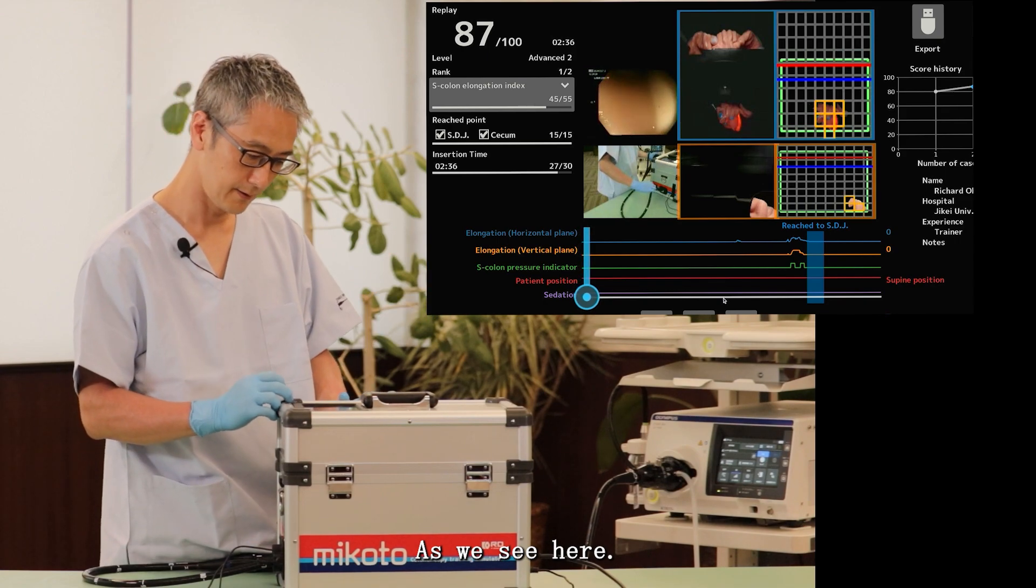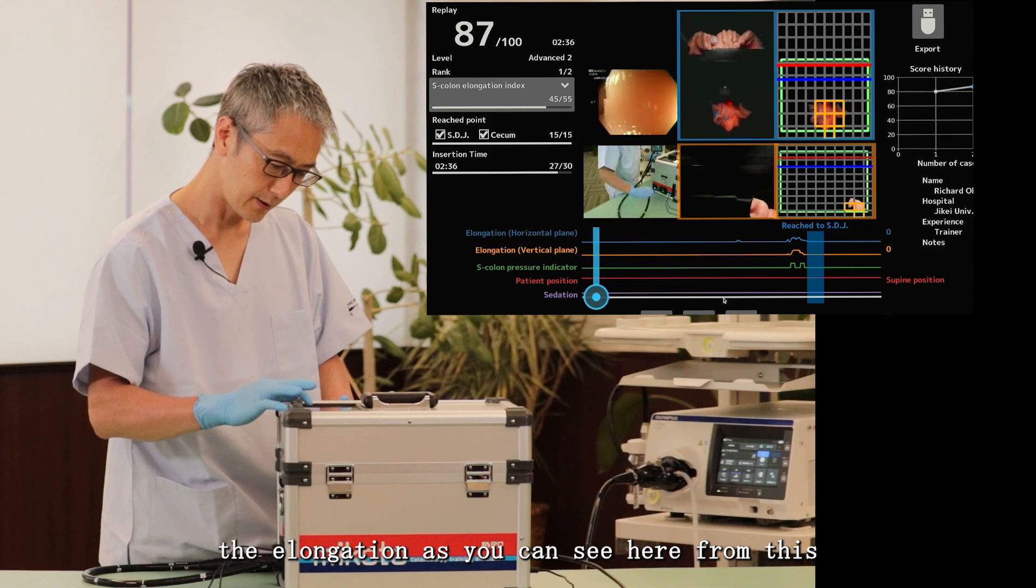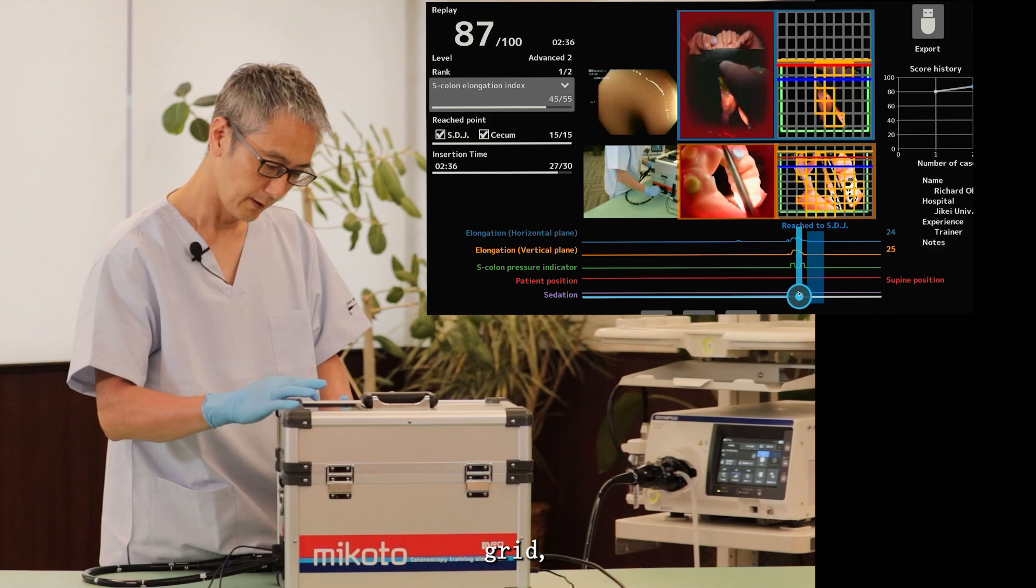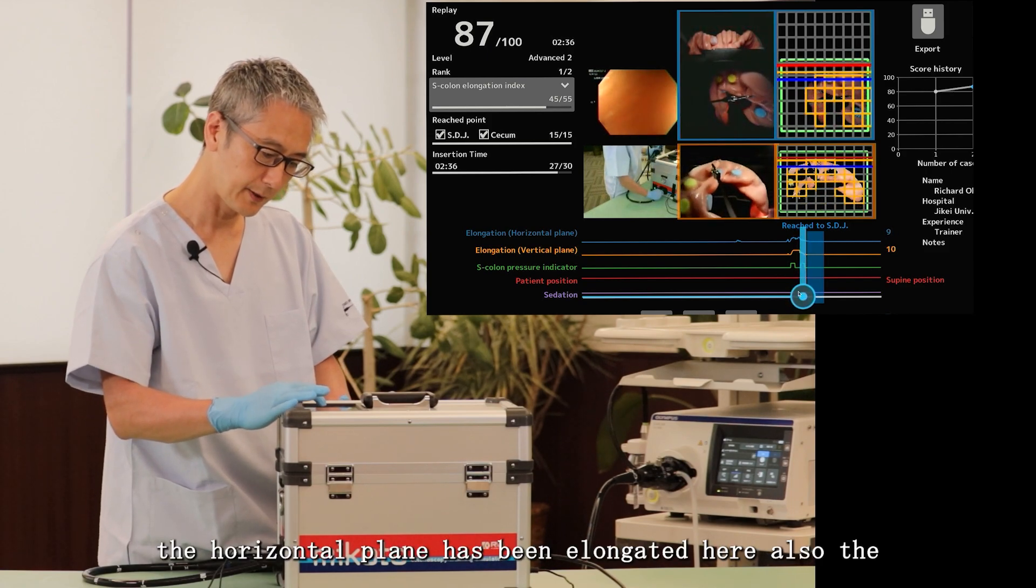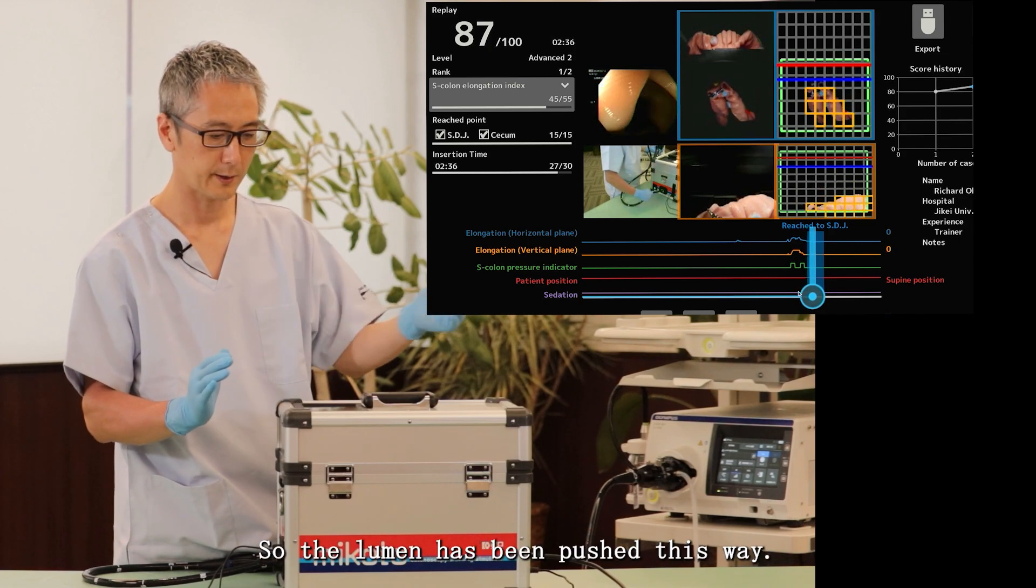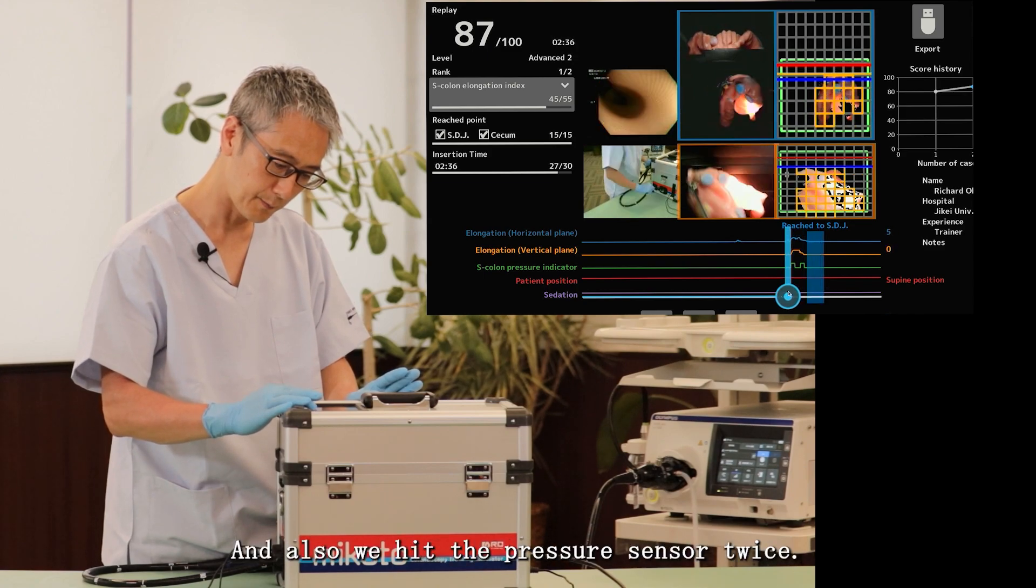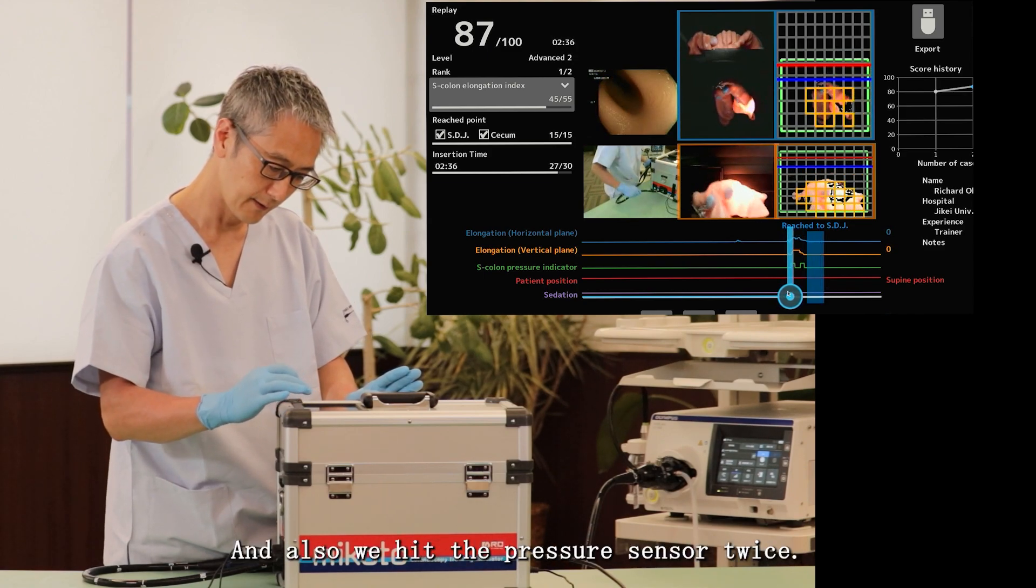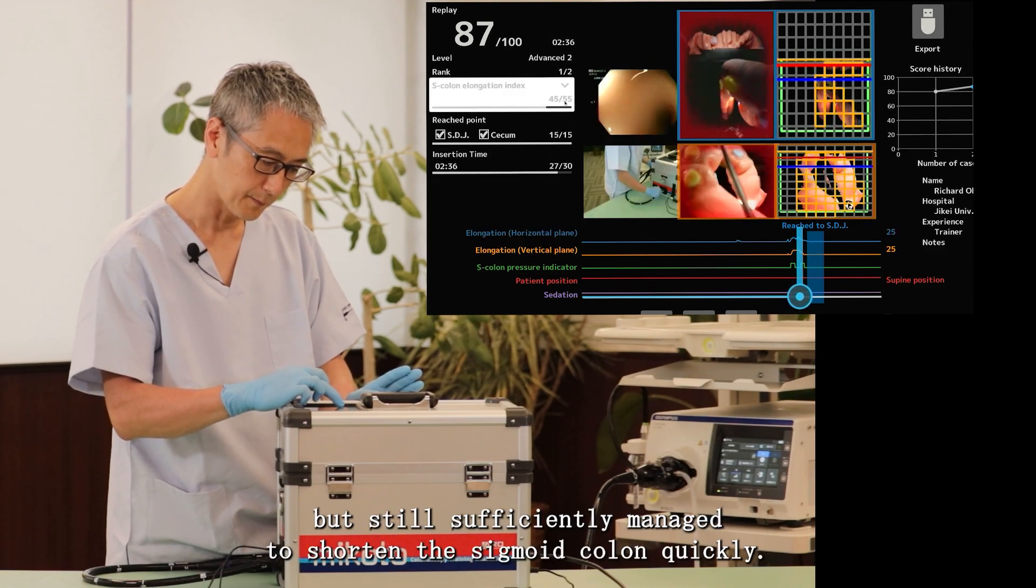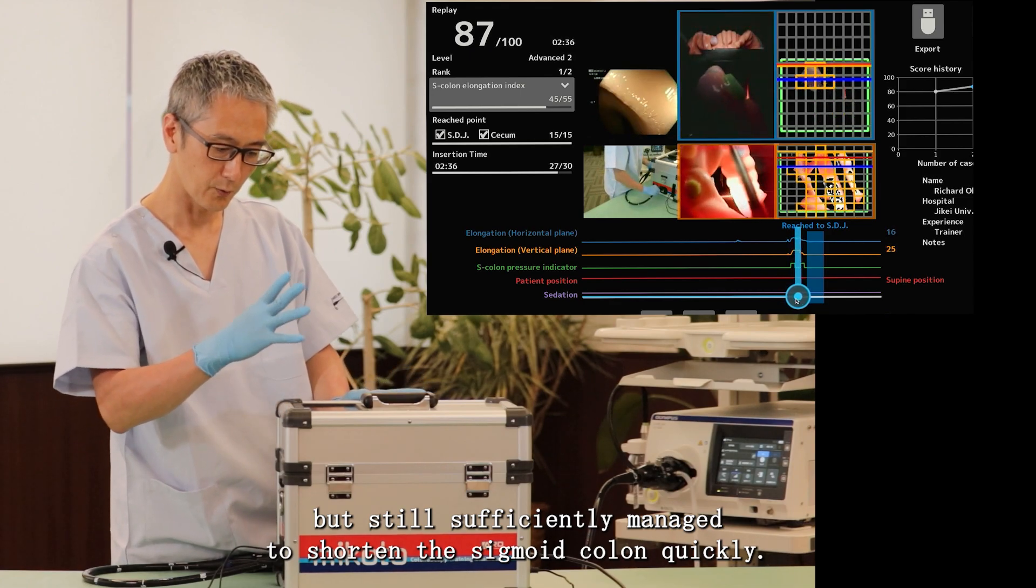As we see here, again the elongation, as you can see from this grid. The horizontal plane has been elongated here, also the vertical plane. So the lumen has been pushed this way, also this way. And also we hit the pressure sensor twice. That's why I lost a couple of points.